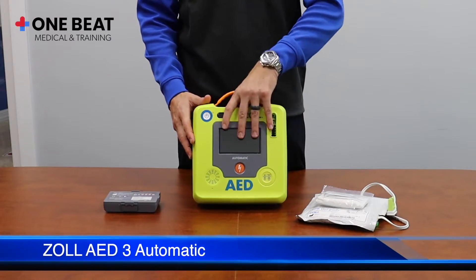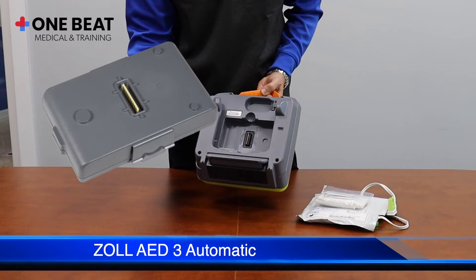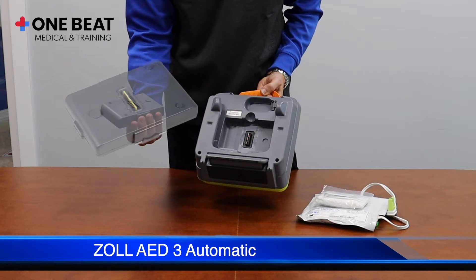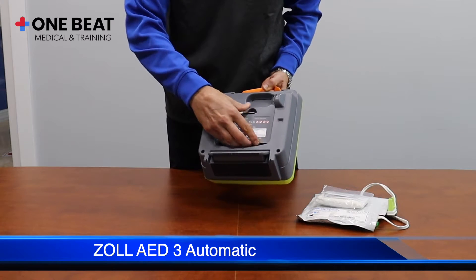This is the Zoll AED3 automated external defibrillator. Install the battery into the back lower section of the AED. The battery cartridge is keyed and can only be installed one way. Make sure you hear a click, which indicates the battery is completely seated in the AED.